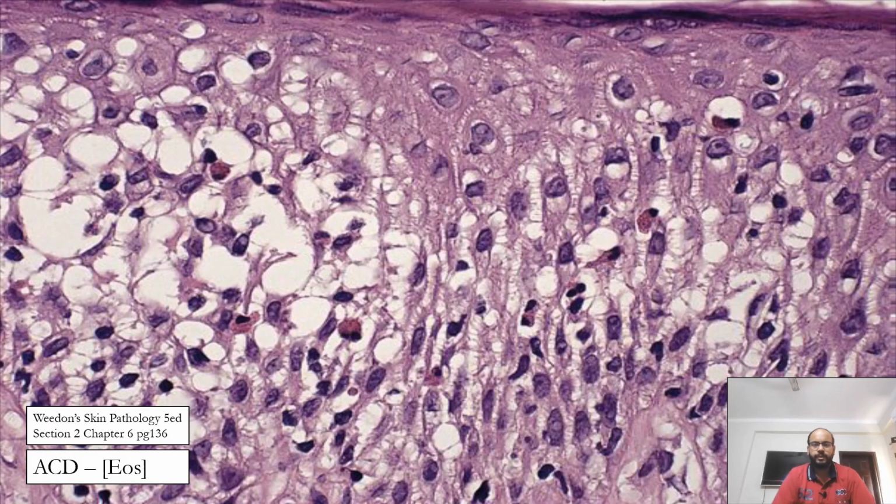So that is just a severe and intense form of ICD leading to epidermal clefting. And at this level, you will see bulla, not so much as vesicles, but this kind of epidermal damage usually leads to a good amount of necrosis. You can in fact appreciate a little bit of finding here, and it shows paler keratinocytes, and that is just because of inflammation of the keratinocytes. Let's move forward.